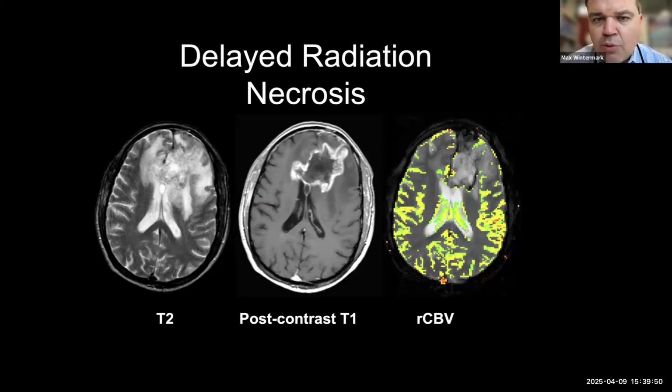Another situation where perfusion imaging is helpful is when you follow up patients and you are trying to determine if new enhancement corresponds to recurrent tumor versus radiation therapy changes. So again, in both settings, you are going to have enhancement because in both settings, the blood-brain barrier is typically abnormal. And so that's why you see the bright signal on the post-contrast T1 weighted images.